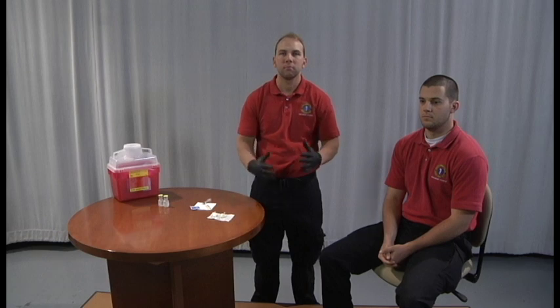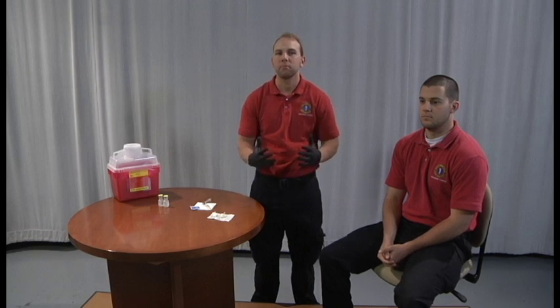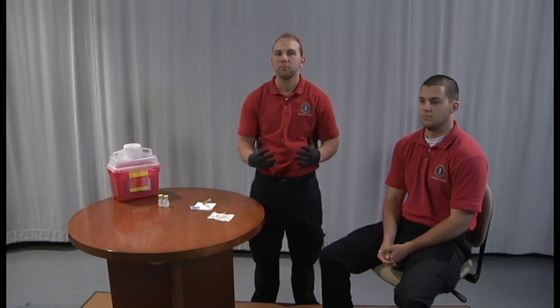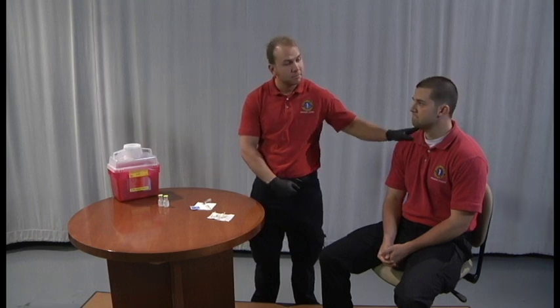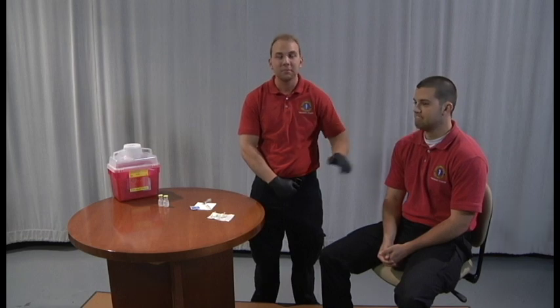Begin by taking appropriate body substance isolation. Assure that the patient is being oxygenated and ventilated appropriately if necessary. Ask the patient for known allergies and clearly explain the procedure to the patient.